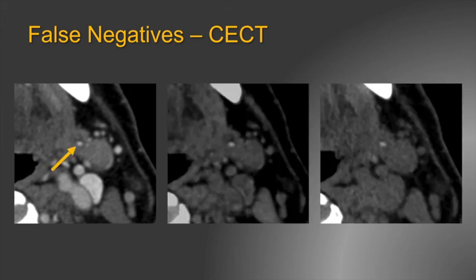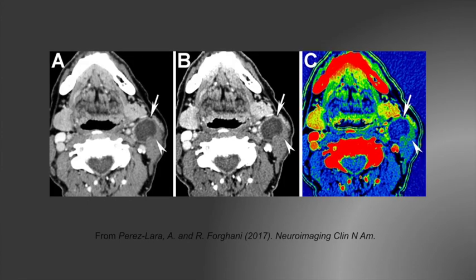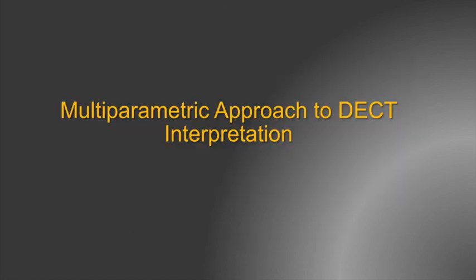small vessels. Now I'm showing you on the right the virtual unenhanced image created from the contrast enhanced image using dual energy CT, which is in the middle, as well as a true unenhanced image demonstrating a small stone at the submandibular gland hilum that was not clearly distinguishable on the contrast enhanced CT acquisition. Therefore, if you have a dual energy CT scanner, make sure you take advantage of these reconstructions. Some of the applications we discussed can also be used for better delineation of inflammatory changes in different lesions.